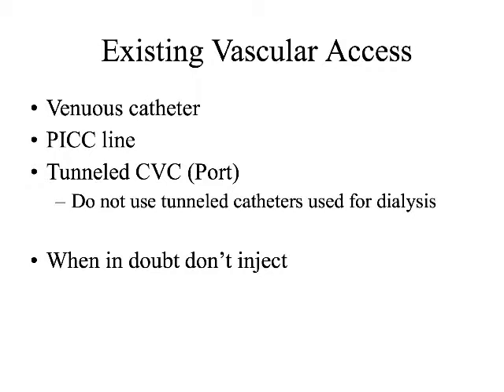So if there's existing vascular access, we can use that, but we want to be very careful about how we use it. If they have a venous catheter already in place, if they have an IV already in place, we will test it with some saline. Saline is not considered a medication. It's considered basically preliminary work to doing the IV contrast injection.